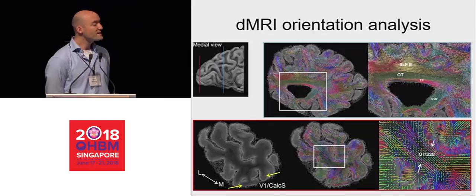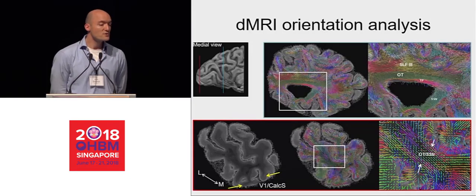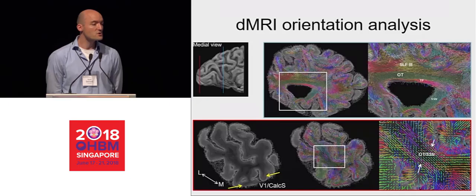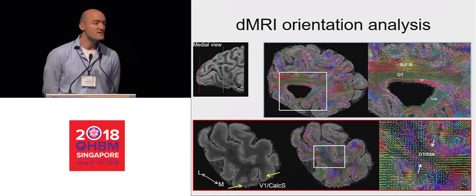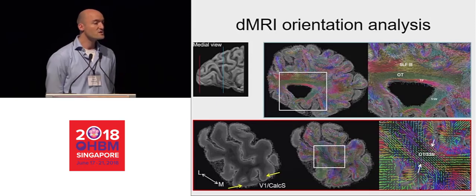You can see that right in the middle of white matter there is a much darker spot that actually corresponds more to the right to the green colors of the optic tract. So even within white matter, you can see that there's interesting contrast for the highly myelinated optic tract in the T2 star imaging there. If we go all the way to the right, this is a crossing fiber analysis using the multi-shell data. So this is a ball and stick analysis.